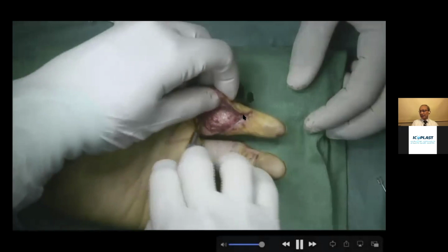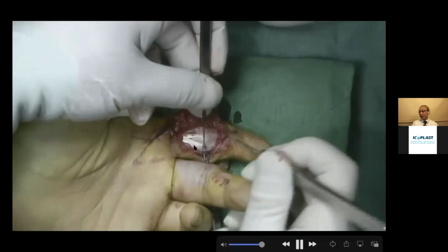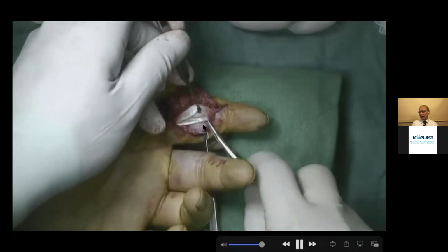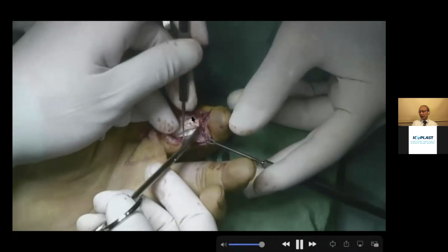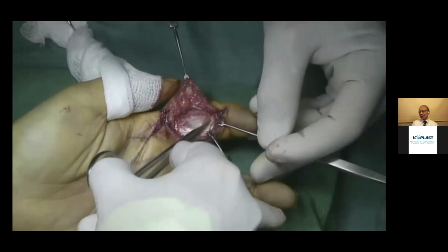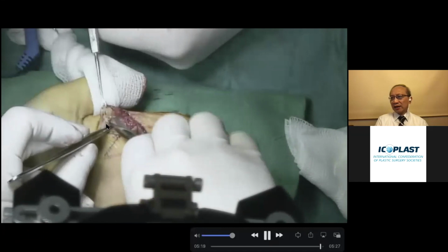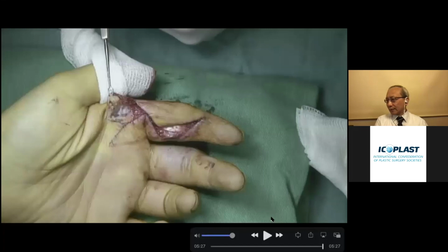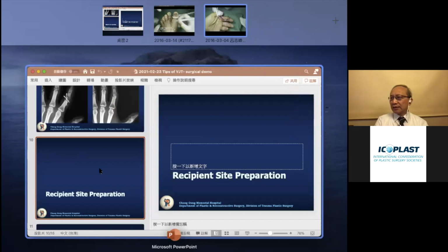So we have already dissected the lateral surface, and now we open up the flexor sheath and do tenolysis again. Not too severe, but we have to try to release it, and release the FDS, because the FDS inserts on the middle phalangeal base. We try to detach part of the insertion at the proximal part of the middle phalangeal base. That allows us to resect the PIP joint. And then for the recipient artery, not too typical, you can find the digital artery at the MP joint level. Okay, so that's the first part of the dissection. And then on to the donor side.